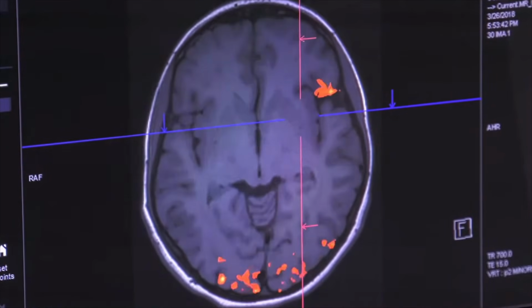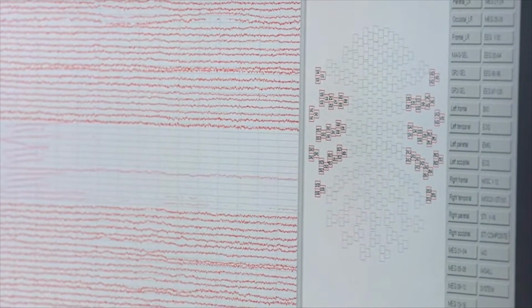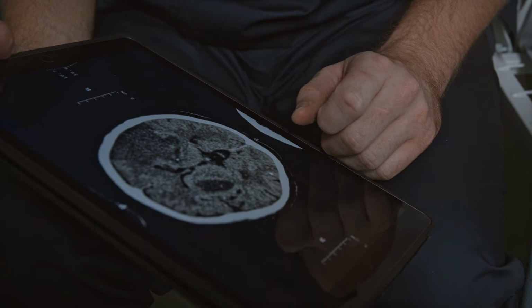Differences in ERP components can indicate differences in the processes they reflect. Deviating ERPs can therefore be an indication of motor, sensory, or cognitive deficits. Therefore, ERP abnormalities are investigated in clinical studies of various psychiatric and neurological disorders.